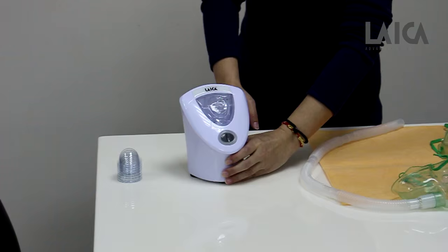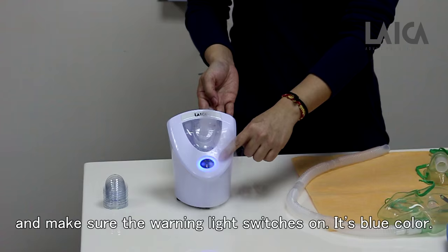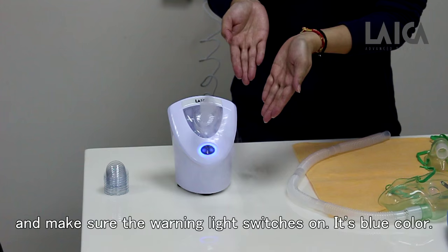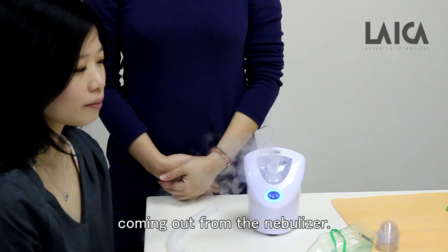Press power button to switch on the nebulizer. And make sure the warning light switches on its blue color. Now you will see the fine mist of your medicine coming out from the nebulizer.